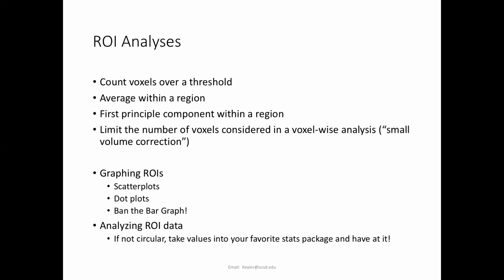So this is generally not recommended. Poldrack says don't do it. I have done it in the past, but probably better is to do something like averaging the fit coefficients within that region and then using that. Apparently SPM uses the first principal component of the voxels that are in your ROI, with the idea that that's sort of like the main driver of that ROI's similarity, I guess, the similarity of the voxels within the ROI.